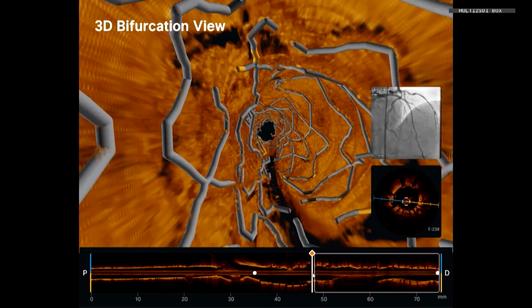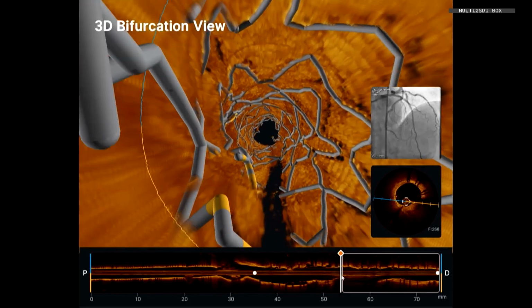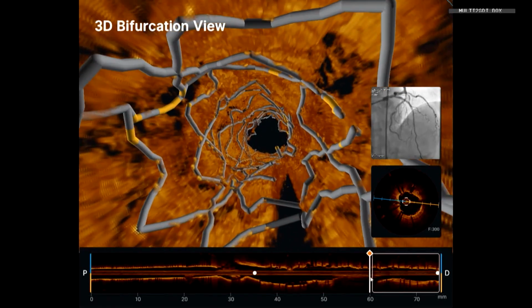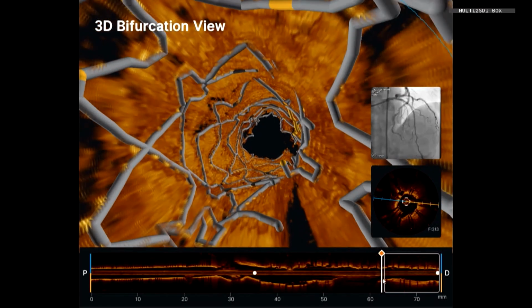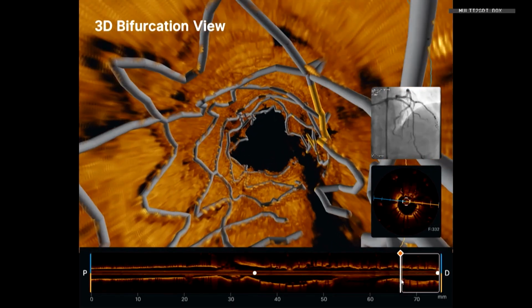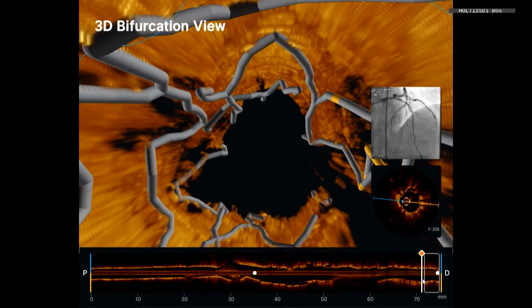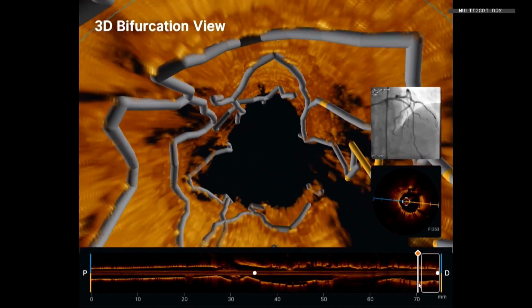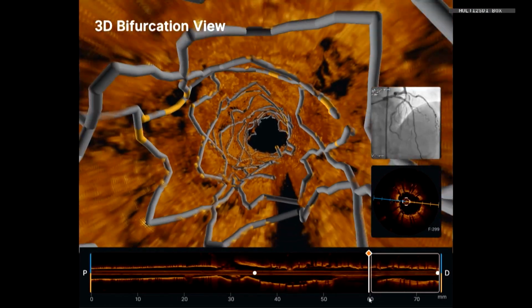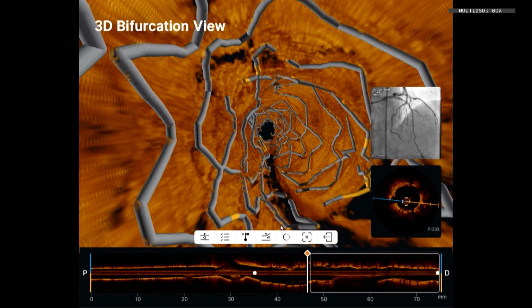Thank you. Give me a post-dilating balloon, NC, first 3 and then 3.25. So this is in the vessel, and it looks well opposed. There are no red signals, but still our job is we are going to do aggressive post-dilatation. And in the meantime, as I was mentioning, we thought of doing a drug-eluting balloon to that high obtuse marginal. Okay, can you show that image also? Yeah, excellent.